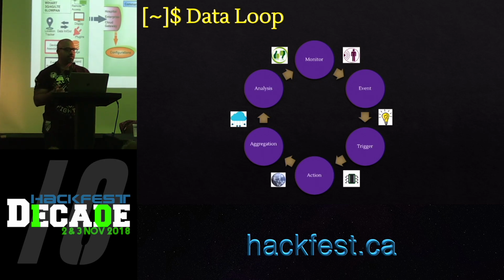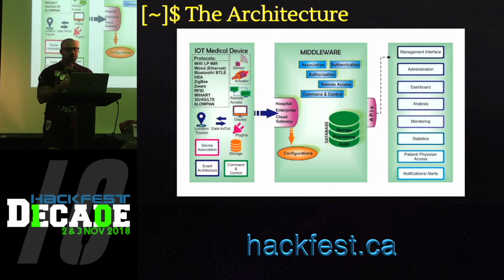So in terms of architecture, the medical device itself, which is on my side, has a lot of subsystems. As I mentioned, it can talk over a lot of different protocols. It would have sensors and actuators to detect a variation in pattern. It would have a display. It might have a location tracker, like if it's the device that's monitoring your location, tracking your steps, and so on. Device association is the module that handles the authentication and authorization of a device to different connected systems. It would have a small storage to store data temporarily.